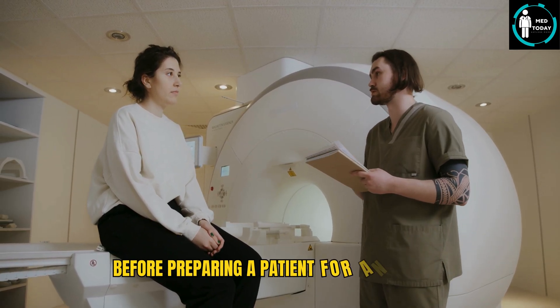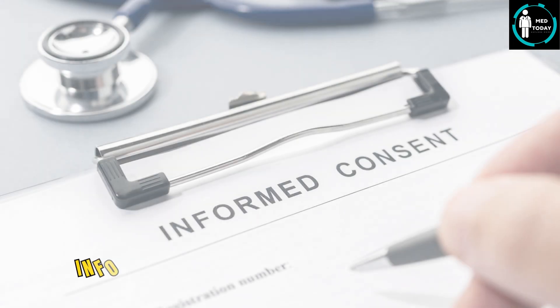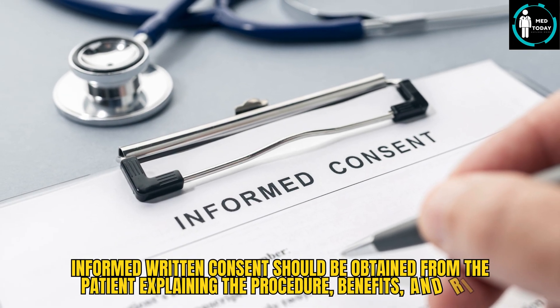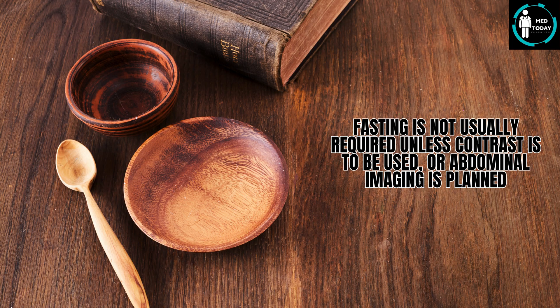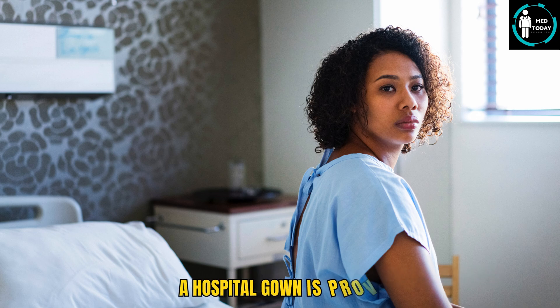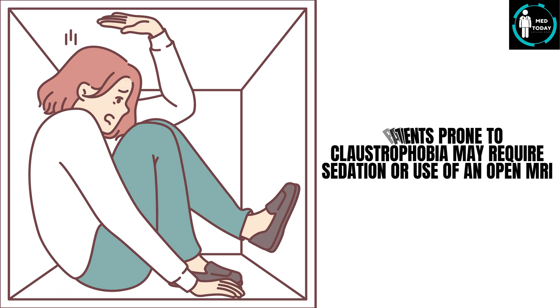Before preparing a patient for an MRI scan, they are screened for contraindications, which will be discussed at the end of this video. Informed written consent should be obtained from the patient explaining the procedure, benefits, and risks. Fasting is not usually required unless contrast is to be used or abdominal imaging is planned. The patient must remove all metal objects from the body, and a hospital gown is provided. Patients prone to claustrophobia may require sedation or use of an open MRI.